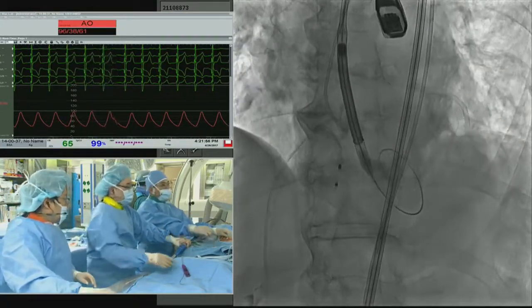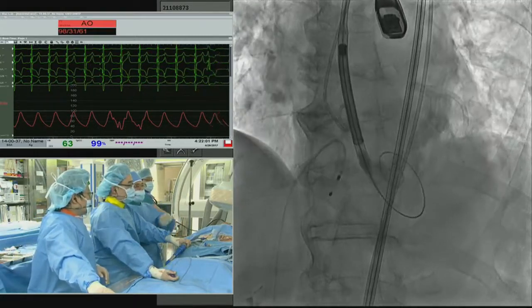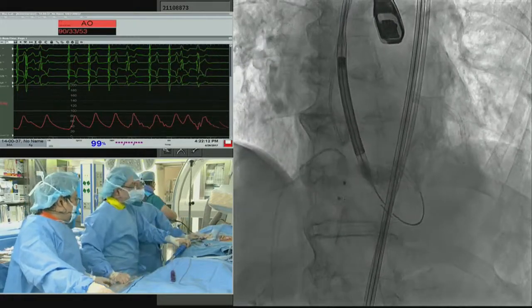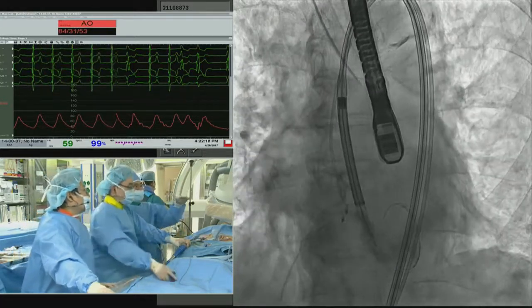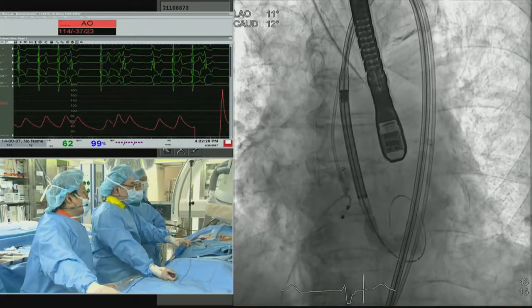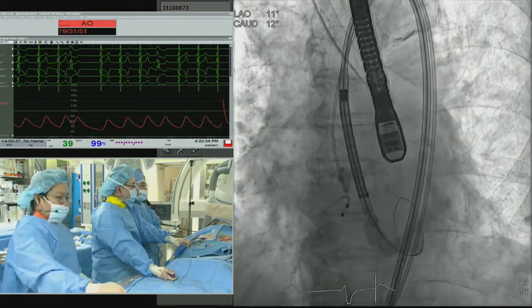Yeah, the blood pressure is okay, and under the three-cusp view, you can see this is the three-cusp view, and then we change the direction caudally. Caudal. You can see one straight line. Can you see the lowermost portion? Yes, the opaque portion was somewhat oval. Now it's straight, which means that we are looking perpendicularly.